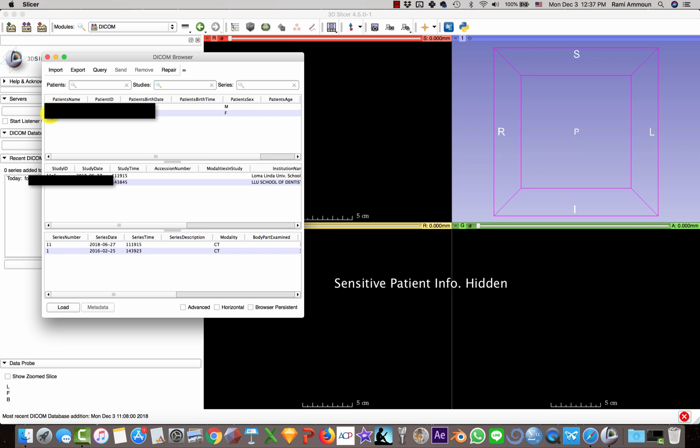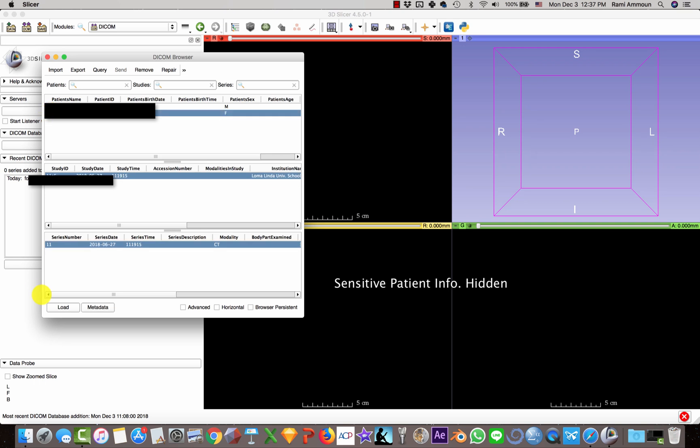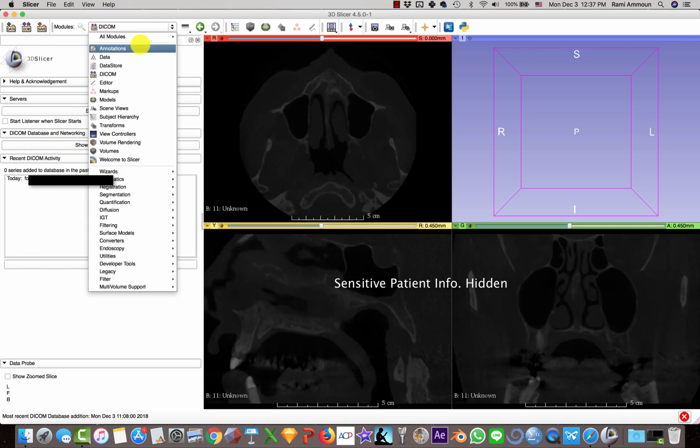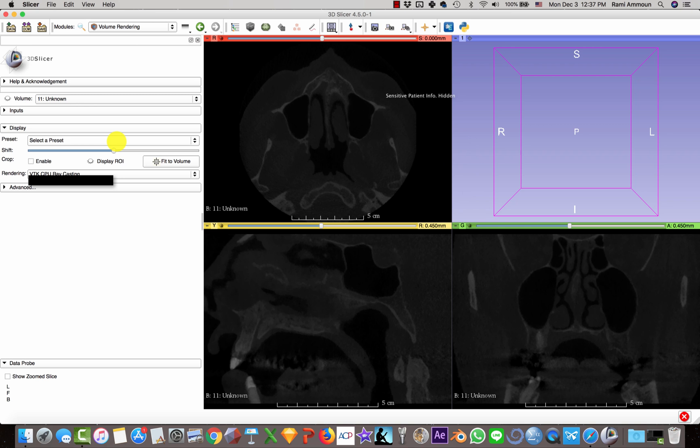Select the patient, click Load, then you're going to go to Volume Rendering, select the GPU ray casting, and enable the region of interest.